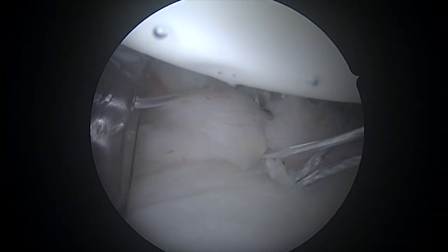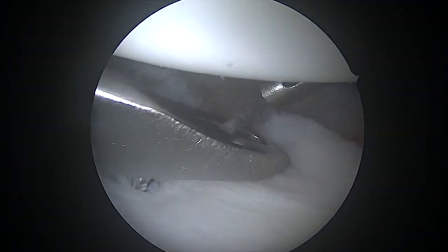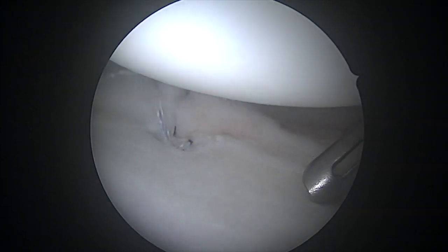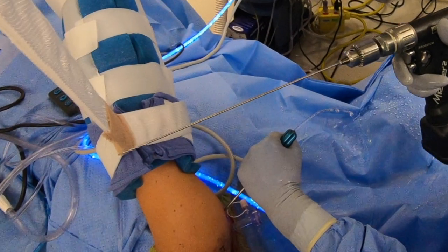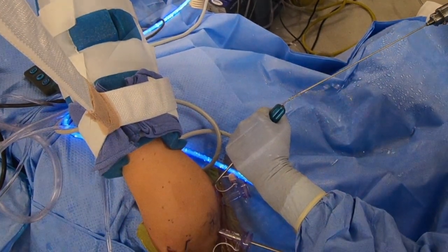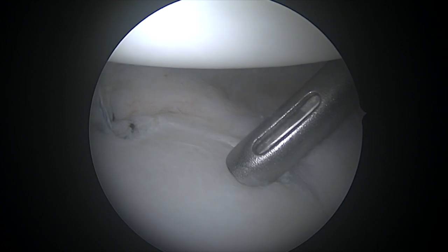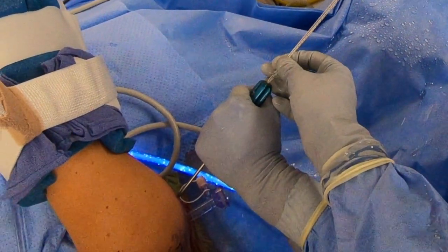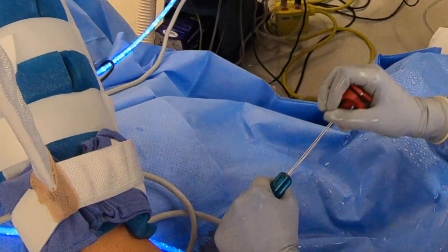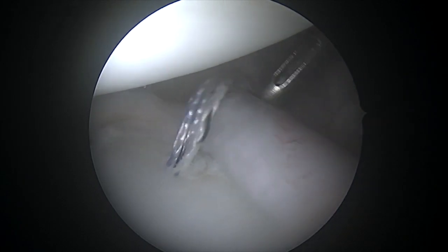We're repeating that same process here using that curved needle that passes our monofilament suture and then using that to pass around and then tying. Once we've gotten this one done, we're ready to place our second anchor. We're going to drill one tiny little hole and then place our anchor through this hard tubular sheath. The anchor itself is completely made out of suture, which makes sure it can't rub or hurt anything.